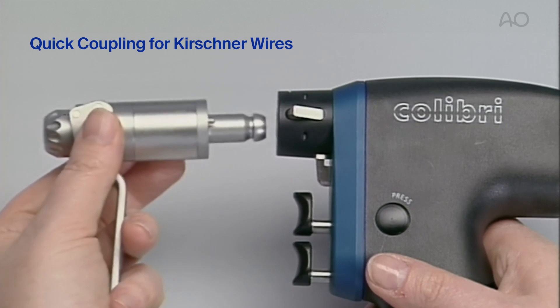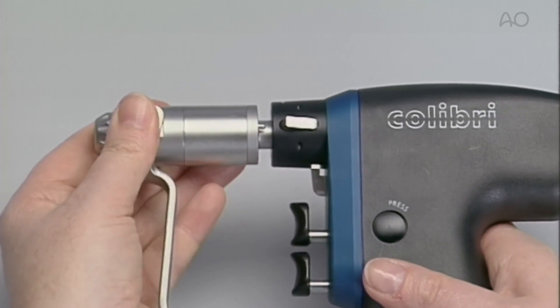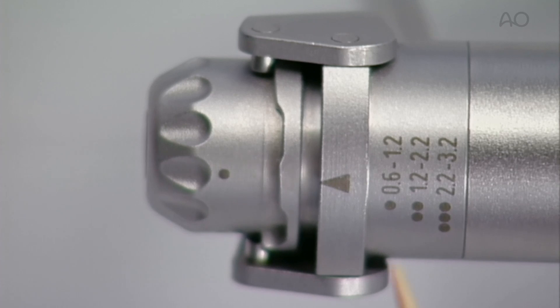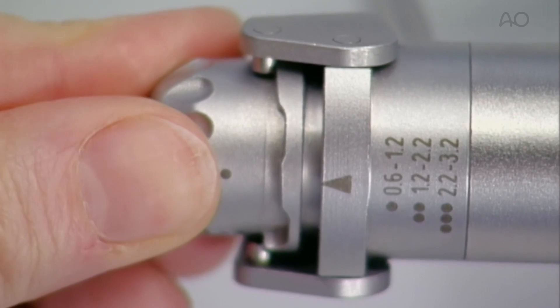The quick coupling for Kirshner wires allows the use of K-wires from 0.6 mm to 3.2 mm. The appropriate range for the diameter of the chosen wire is selected, and the adjustment sleeve is set before inserting the wire.